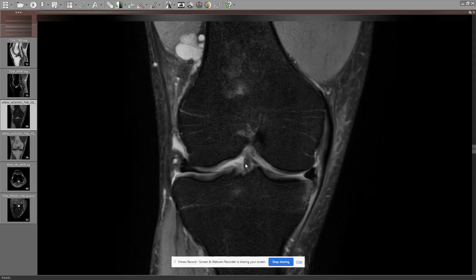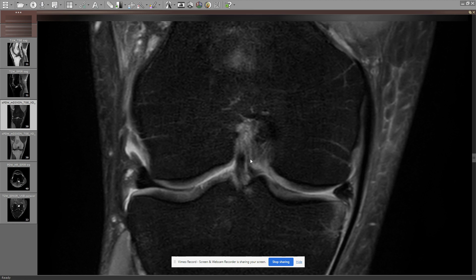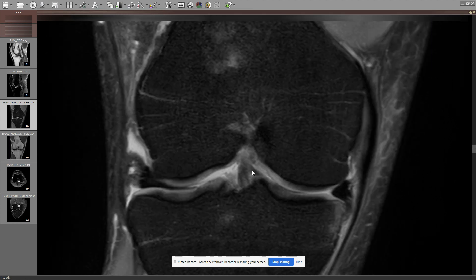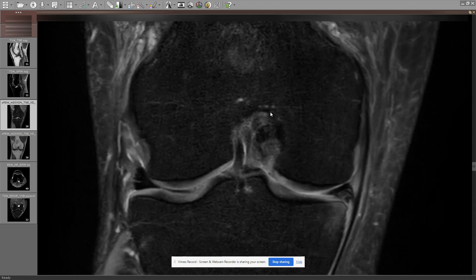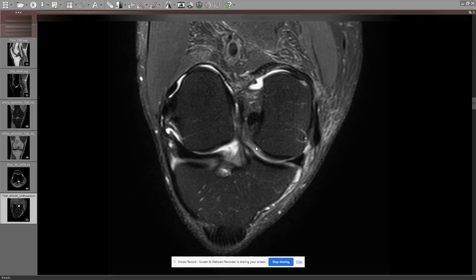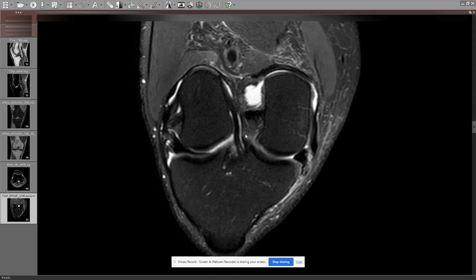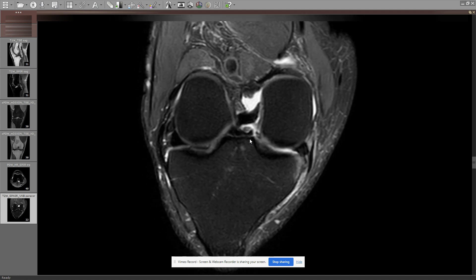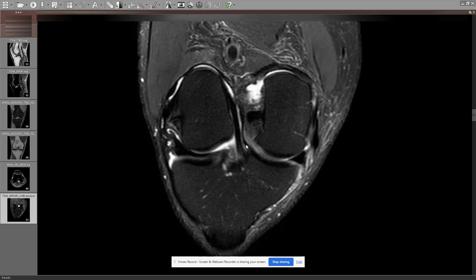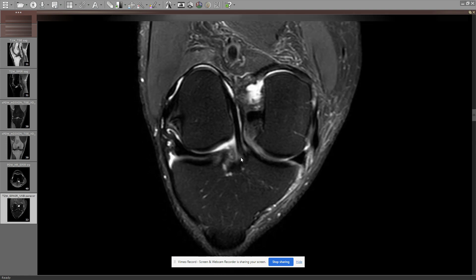Going centrally, we can see the posterolateral bundle coming down nicely. Then we have this second bundle and this line here was confusing me in the speed run, where it just looks a little bit odd. It looks like it's partially inserting into the oblique meniscomeniscal ligament, so maybe there's some form of variation here. This is not something I normally look at in my reading routine. We can see the ACL bundle and posterolateral bundle coming down nicely, and then the posterior anteromedial bundle — very thin.